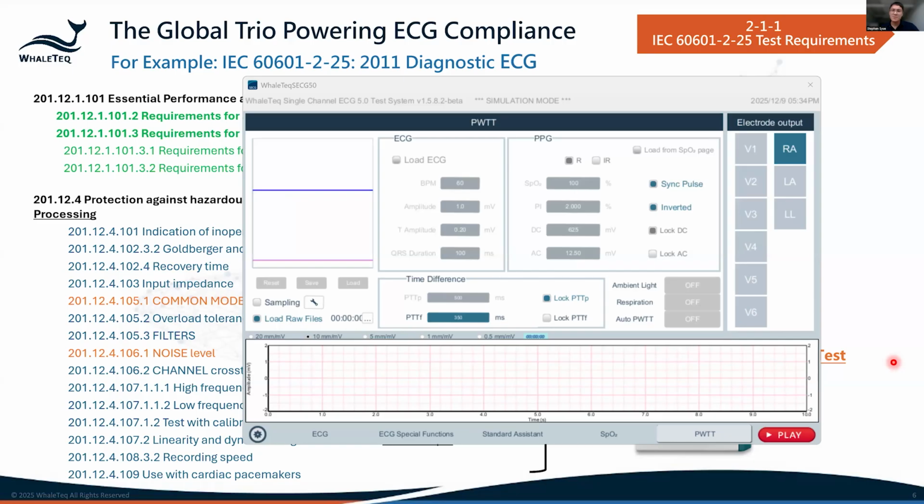Yeah, CMR 51K, very likely. So you can say stronger input impedance will actually contribute to a higher CMR, and they are different aspects of the same matter. So that actually doesn't require different sensitivity, like 12 times. Yeah. Okay.